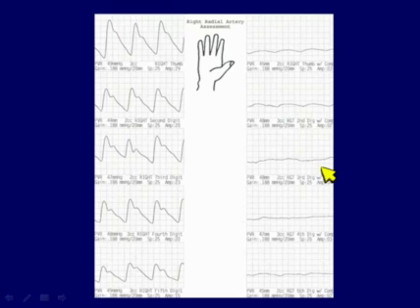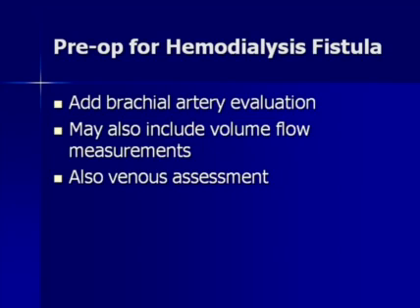So we can safely say that this kind of patient, we don't want to harvest the radial artery to use for coronary bypass, because we probably will get some digital ischemia, and this is a result of the fact that the person is radial dominant and likely has either a small ulnar artery that's not perfusing much, or certainly not perfusing adequately into the hand.